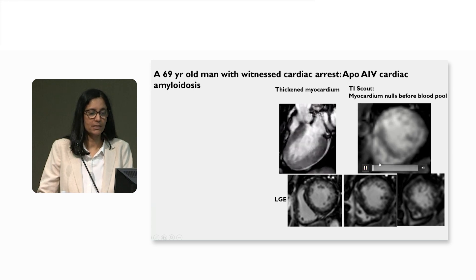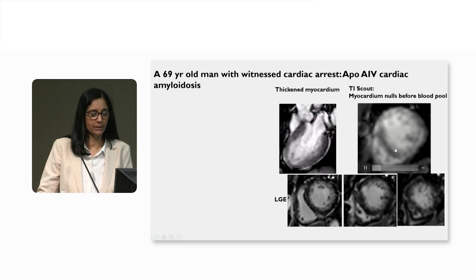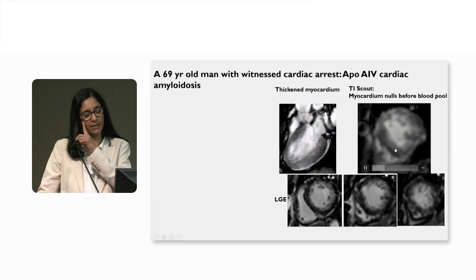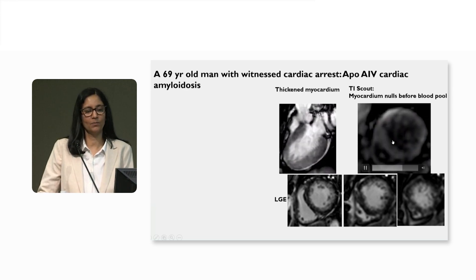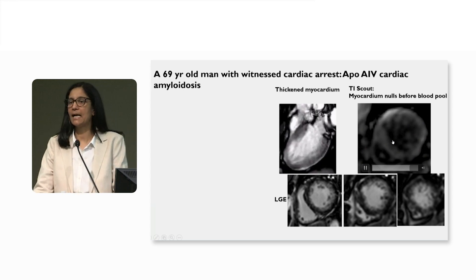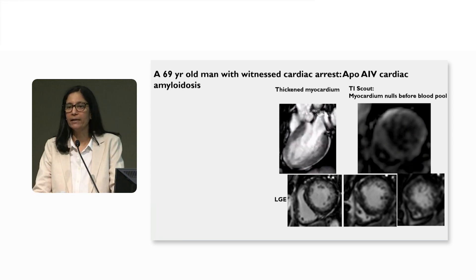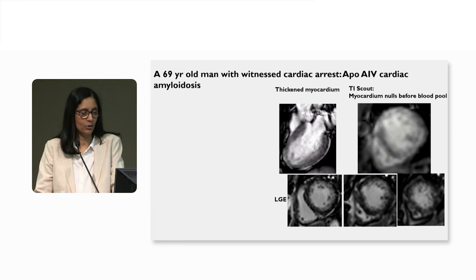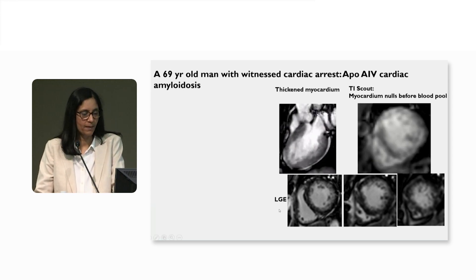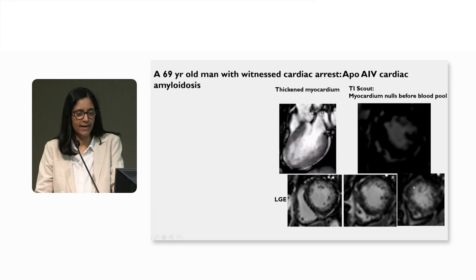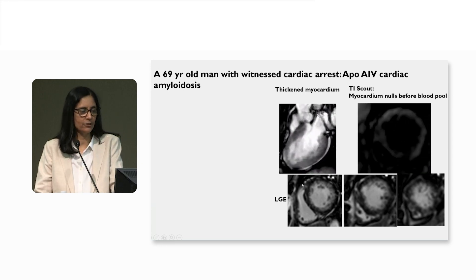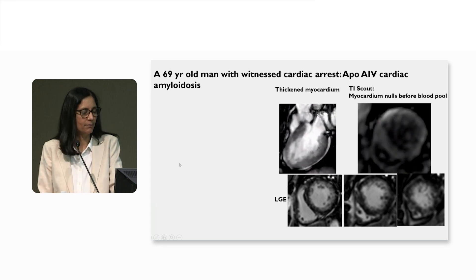On the T1 scout and the inversion time recovery scout, you can see that the myocardium nulls first and then the blood pool nulls — a classic finding in cardiac amyloidosis. On late gadolinium enhancement, you can see this patchy mid-myocardial enhancement, but not too much of a transmural uptake.